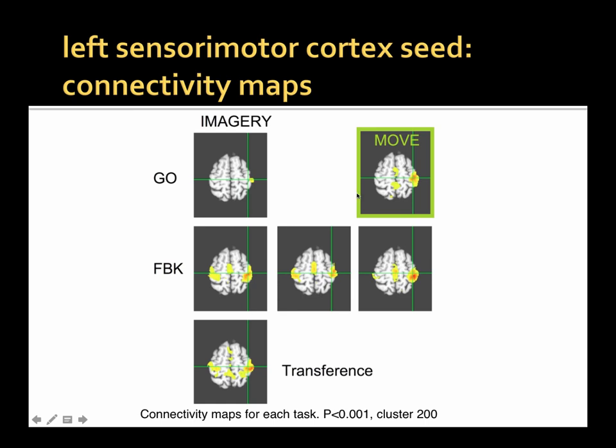And we can see that, as I mentioned before, the movement and the imaginary activations during the go are kind of similar, but the motor cortex is certainly activated during the move and not that much during the imagining. However, when we start putting in the neurofeedback, we start getting more of a network of correlation.